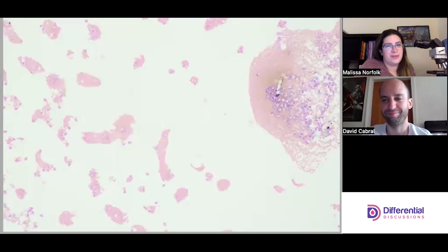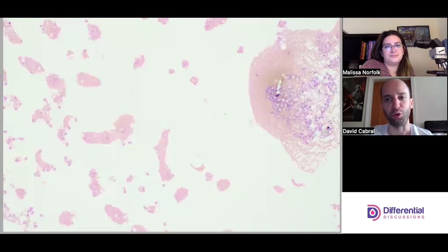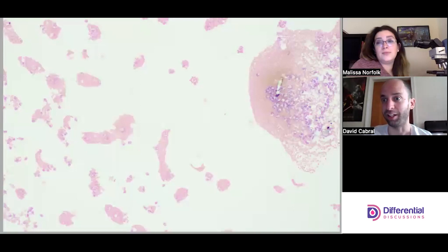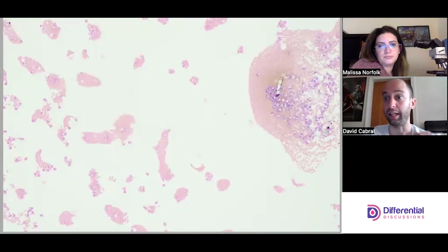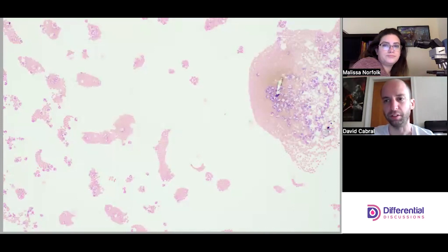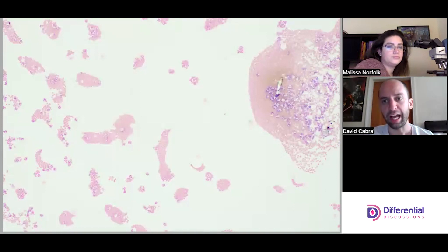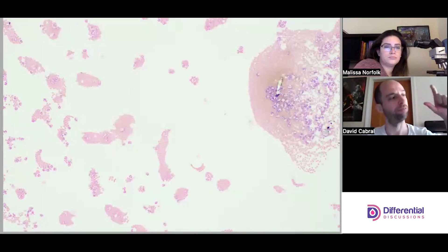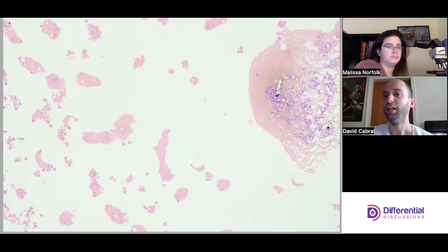Hello and welcome to Differential Discussions. I'm Melissa and I'm Dave, and today we're looking at another synovial fluid — a little bit different, which is good. One thing that stands out is it looks bloody. We talk about correlating cell counts and things like that, and although red cell counts are not particularly important especially in synovial fluids, different institutions might have different procedures. It's important to look at the sample and note that it's a little bit bloody.